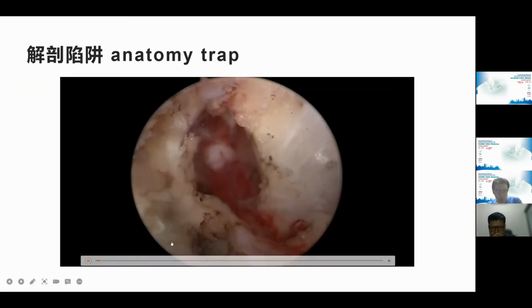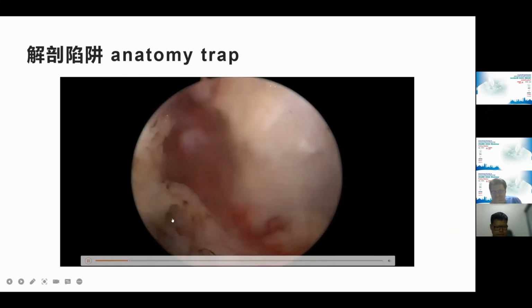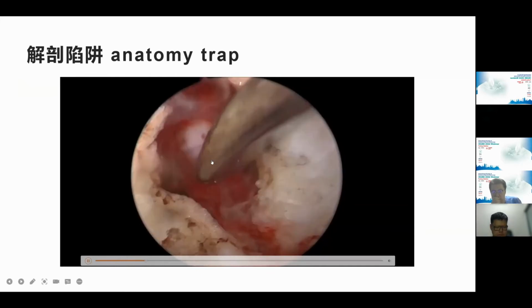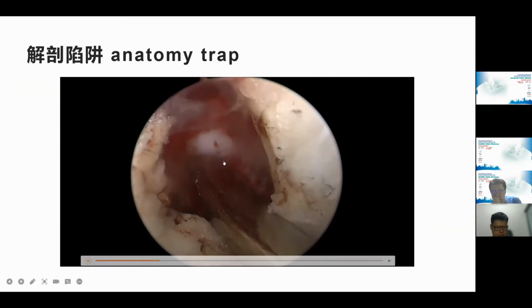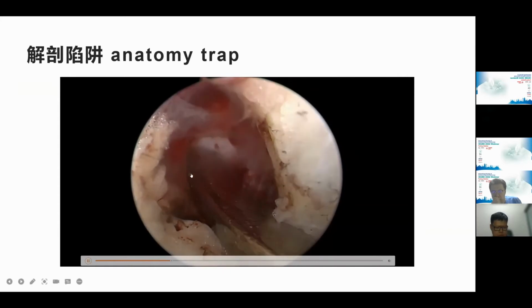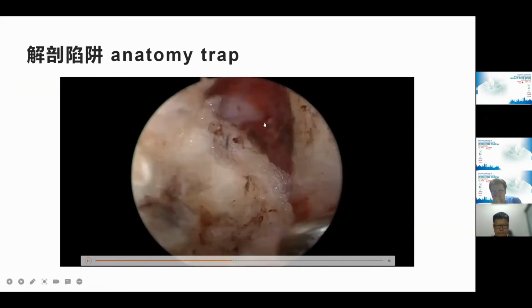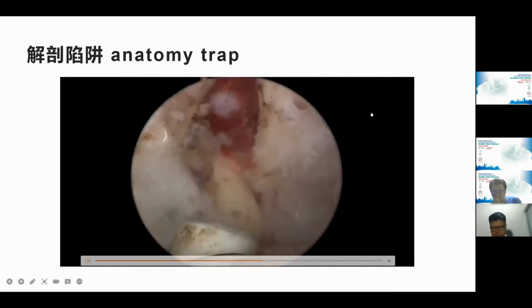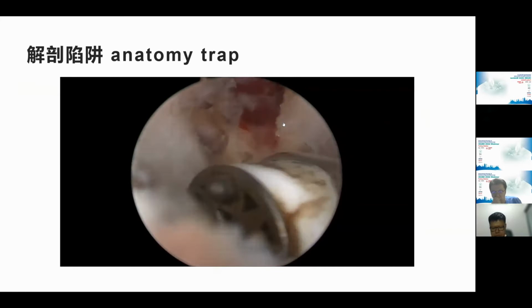If you insert the first rod to build the portal, you'd better check the CT or MR: is there a flavum ligament between the interspinous processes? For this case, you can see there is nothing, only the spinal cord. So it's very dangerous for a beginner to do the cervical UBE procedure.